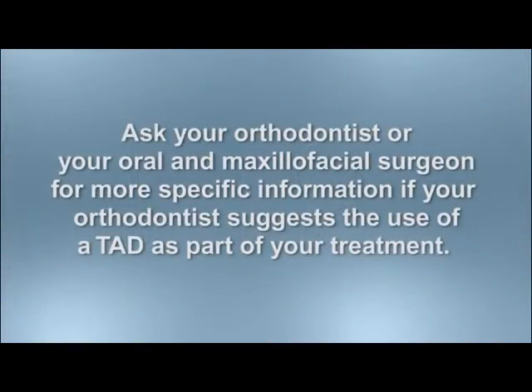When TADs are required for longer treatment periods, their positions may need to be changed. When the treatment is complete, commonly TADs can be removed with no anesthesia or with a topical numbing cream. Questions? Ask your orthodontist or your oral and maxillofacial surgeon for more information.